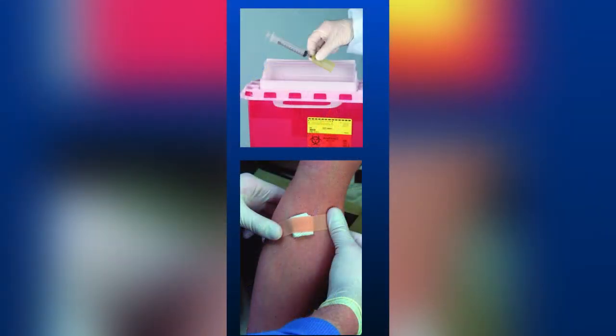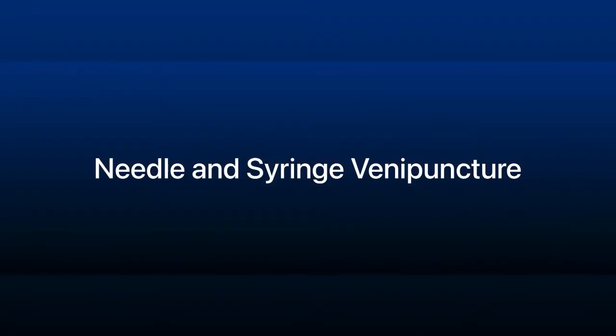Fill, remove and mix tube in order of draw. Place gauze, remove needle, activate safety device, and apply pressure. Discard collection unit. Needle and syringe venipuncture. Same as routine ETS venipuncture.